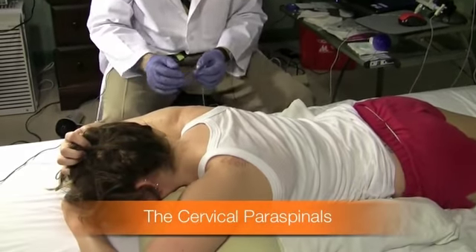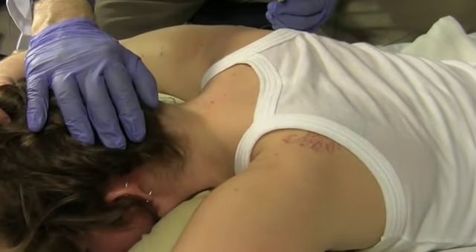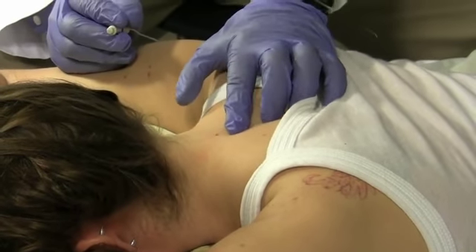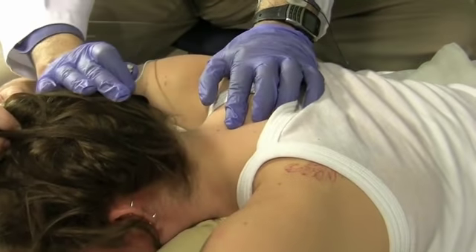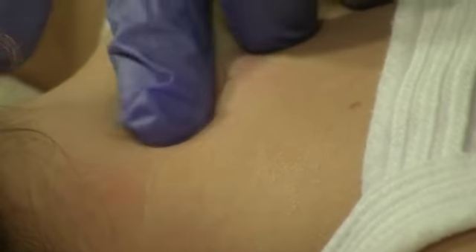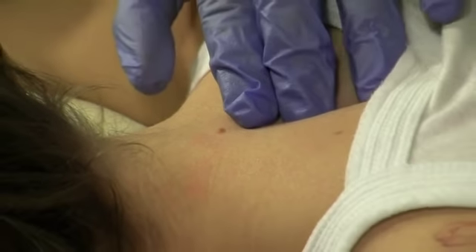And now we're going to do the cervical paraspinals. I've wiped it out with alcohol already. And again, those are not easy to relax. So I have the subject hang their head over the pillow, essentially. And I'm doing the left paraspinals. The way you localize those is look for the C7 spinous process. That's the most protruding bone up here in the neck. That's C7. And one level above that is C6, one level below that is C8, and then T1.